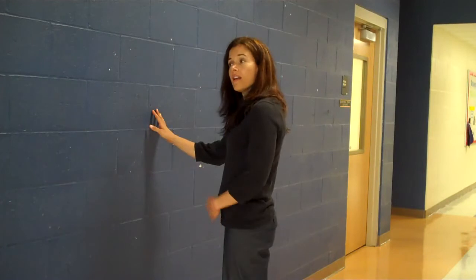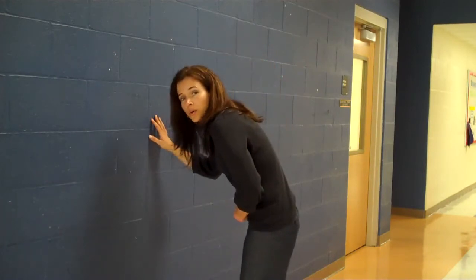During a tornado drill, you would have the child in the wheelchair be escorted outside in the hallway with his typically developing peers. Have the wheelchair face the wall and make sure that that child bends forward into the duck and cover position. You can help the child if they are unable to do this. During a lockdown procedure, you would have the child in a wheelchair follow his peers into a corner of the room that is not visible from the door or windows, and have them sit quietly with his classmates until the lockdown procedure is completed.